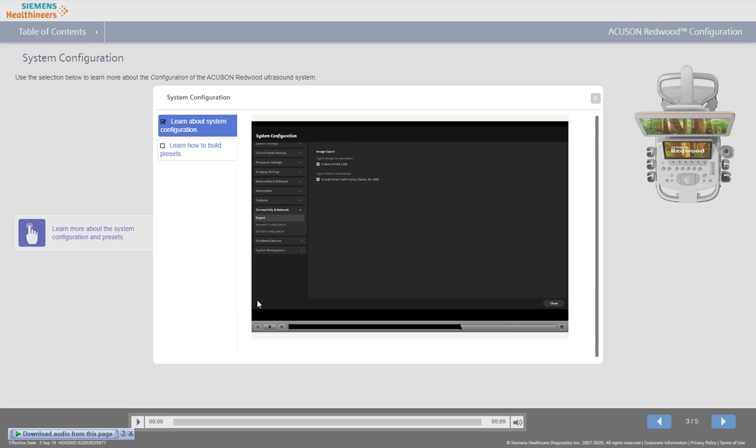The Export submenu allows the enablement of DICOM GSDF, which optimizes the image composition when displayed on a DICOM monitor. If the images will be viewed on an LCD monitor, this feature may be disabled. Additionally, the user can select whether to have an imprint of the patient information on each image. The Network and DICOM configuration submenus are located under the Connectivity and Network menu. For detailed information relating to these areas, please refer to the Connectivity course. Select the Peripheral Devices menu to continue.